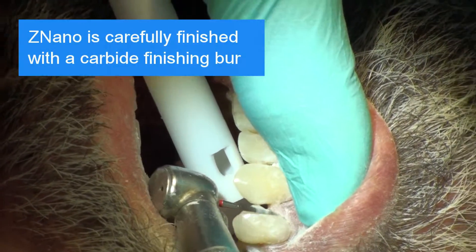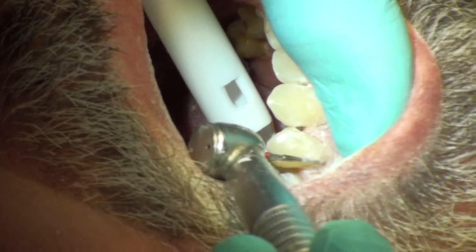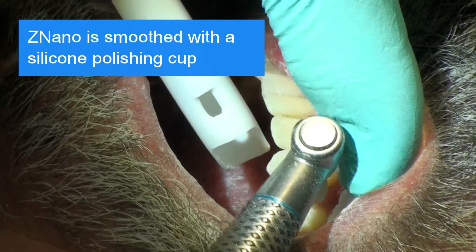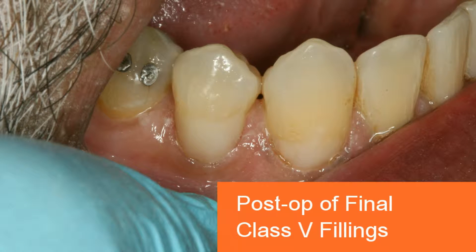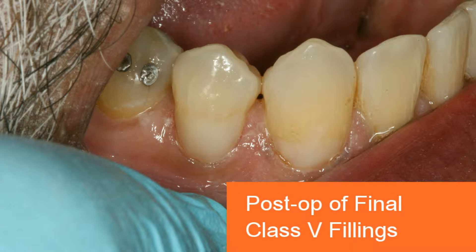Znano is carefully finished with a carbide finishing burr, then smoothed with a silicone polishing cup. The after photo shows the final results achieved in about 11 minutes of clinical chair time.